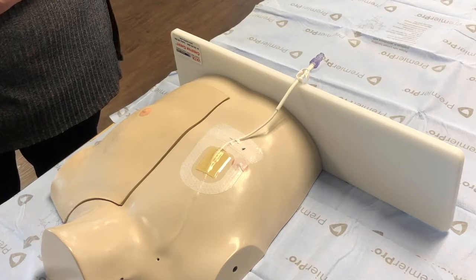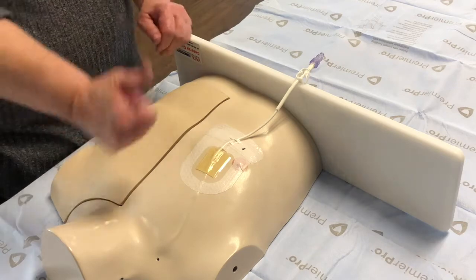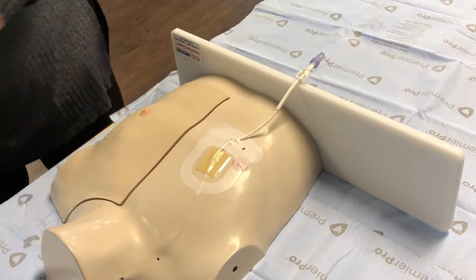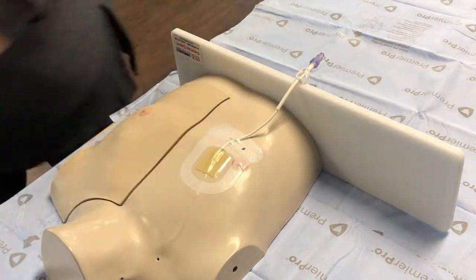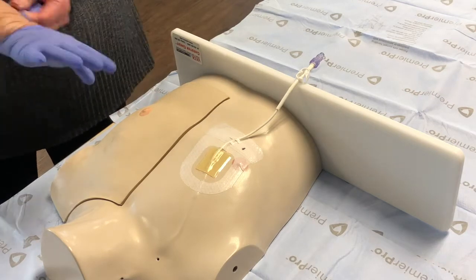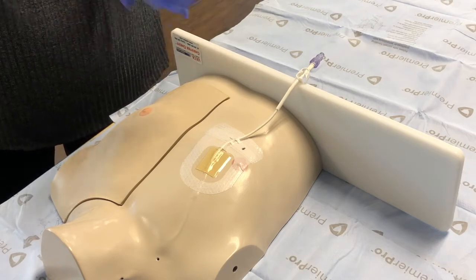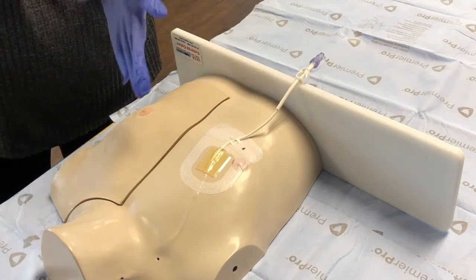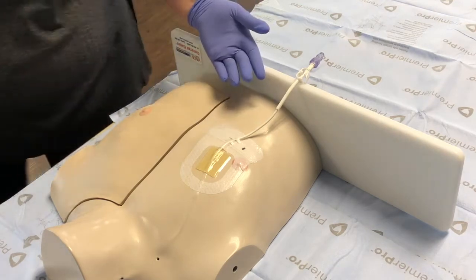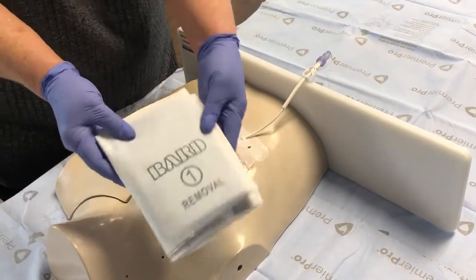First, explain the procedure to the patient and check patient identifiers, including name and date of birth. Wash hands and don gloves. Open the white portion of the dressing kit labeled 1 removal. Leave the blue dressing pack within the plastic wrap.